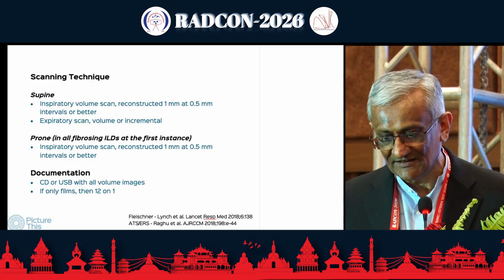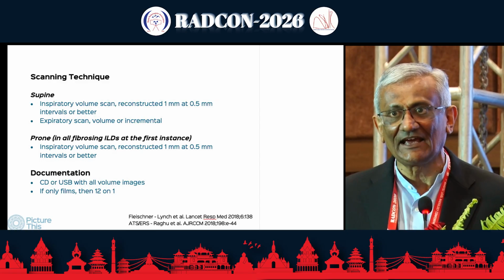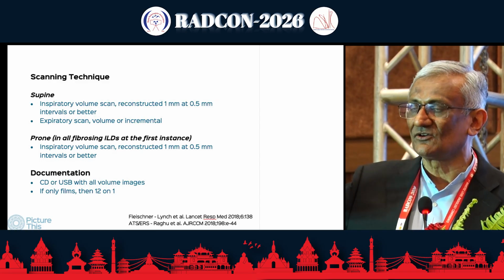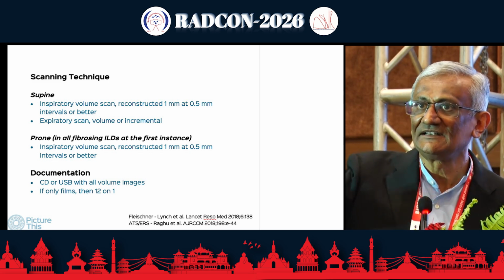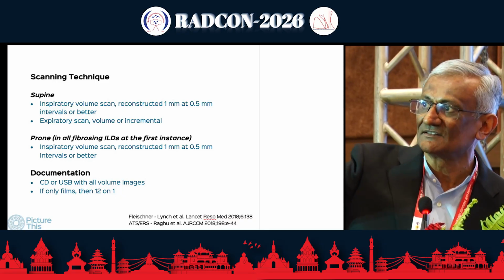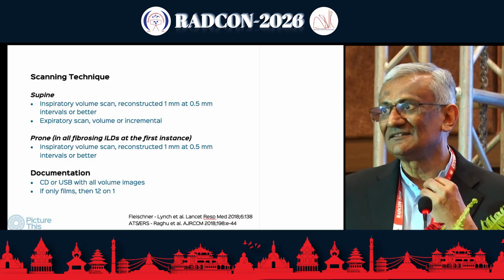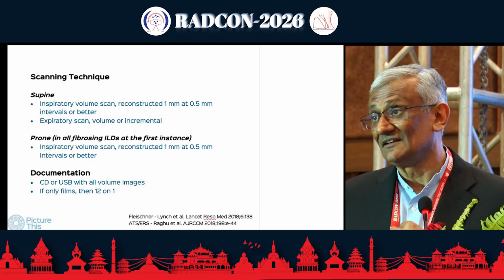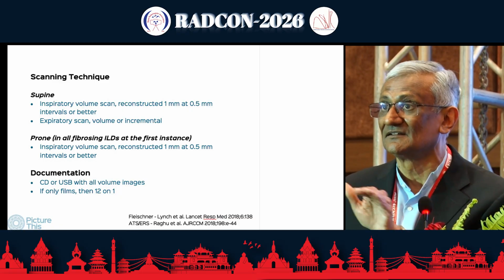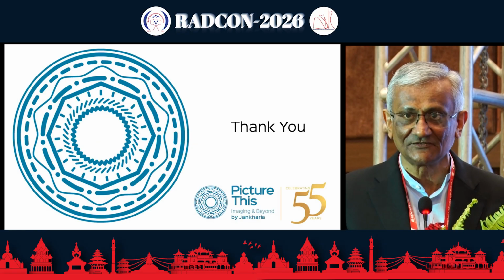It's not rocket science, but this is the protocol that we have. Most important is to train the patient, either the tech or the nurse or somebody who will tell the patient, take a deep breath and hold it, or in Hindi, lamba saans lo, pakad ke rakho. That is important, and that doesn't happen in India in about 70 to 80% of hospitals and scan centers across board. Thank you so much for listening to me.